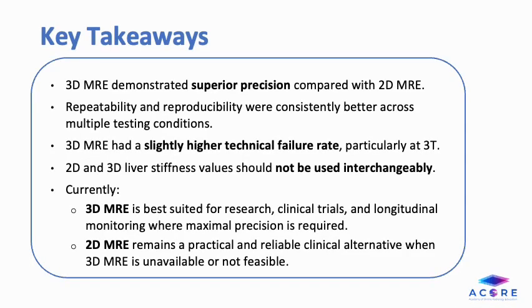To conclude, this study demonstrates that three-dimensional MR elastography provides significantly better repeatability and reproducibility than conventional 2D MRE for measuring liver stiffness in adults with severe obesity. Although three-dimensional MR elastography offers greater quantitative precision, its longer acquisition time and higher technical failure rate currently limit widespread clinical implementation. For now, two-dimensional MR elastography remains a reliable and practical clinical tool, while three-dimensional MR elastography appears particularly valuable for longitudinal monitoring, research studies, and multicenter clinical trials, where maximal measurement precision is essential.